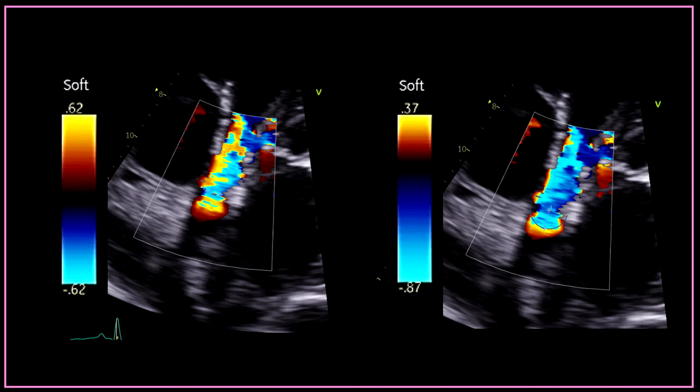I repeat, normally by just shifting the baseline you can accomplish this, but sometimes you will have to also adjust the color scale. As you can see now on the right-sided image, the top number is now 37 and the bottom number is 87.